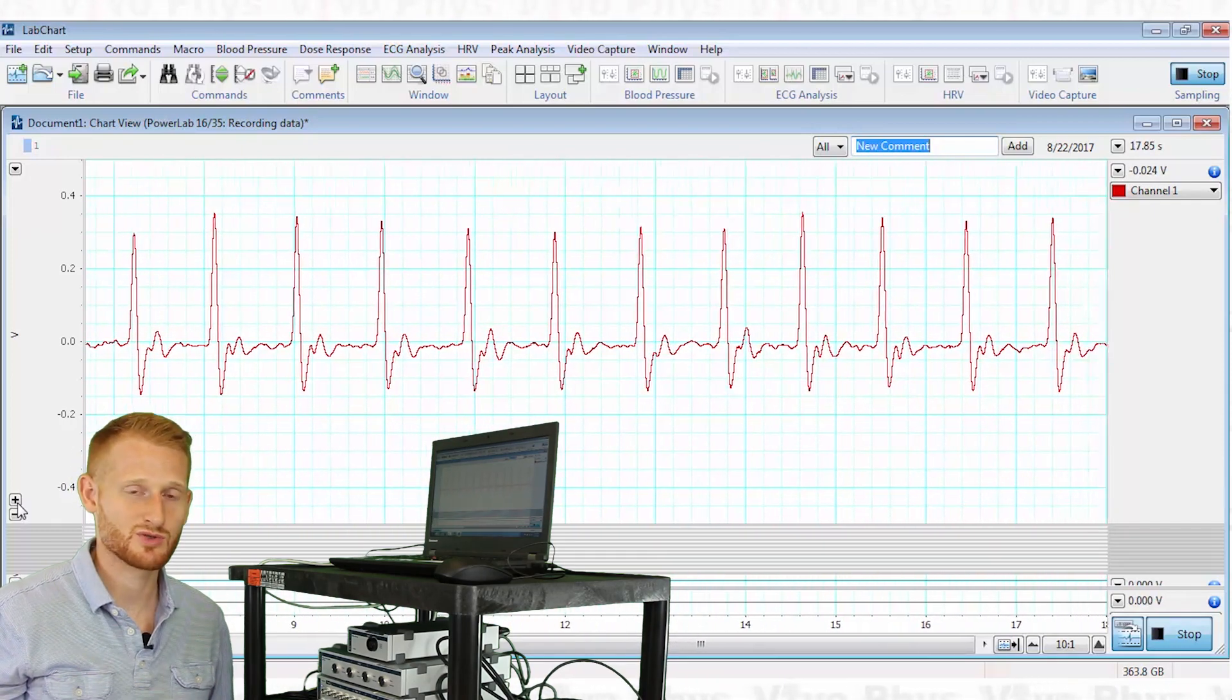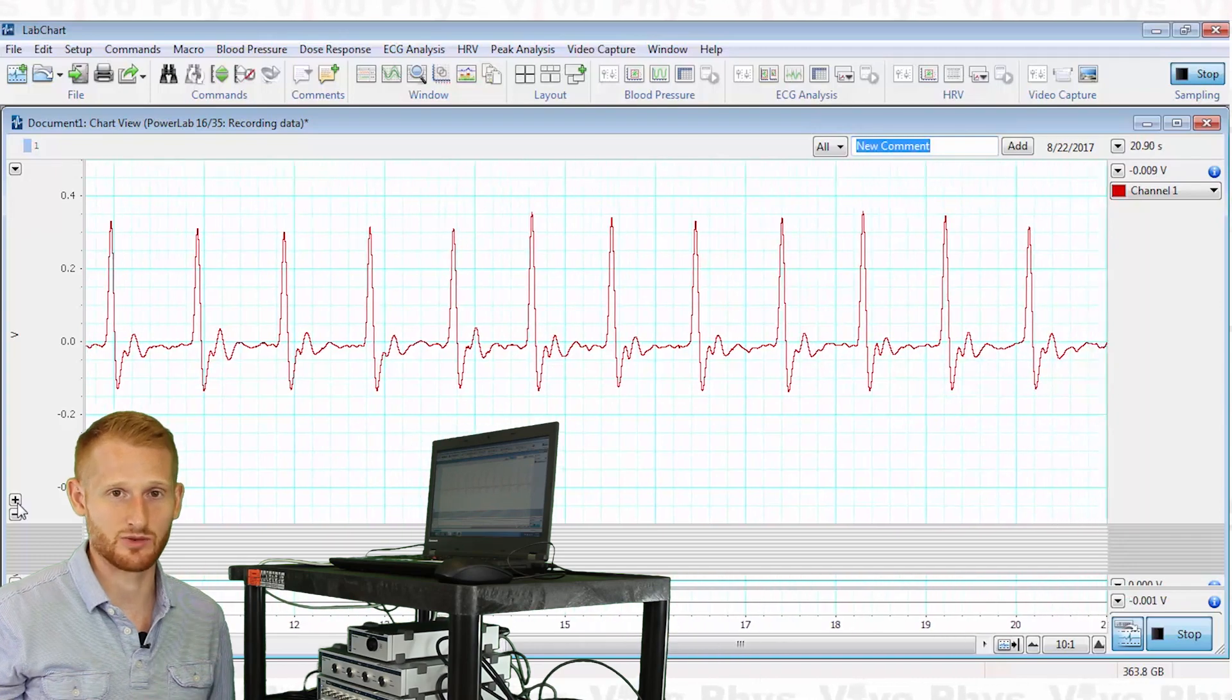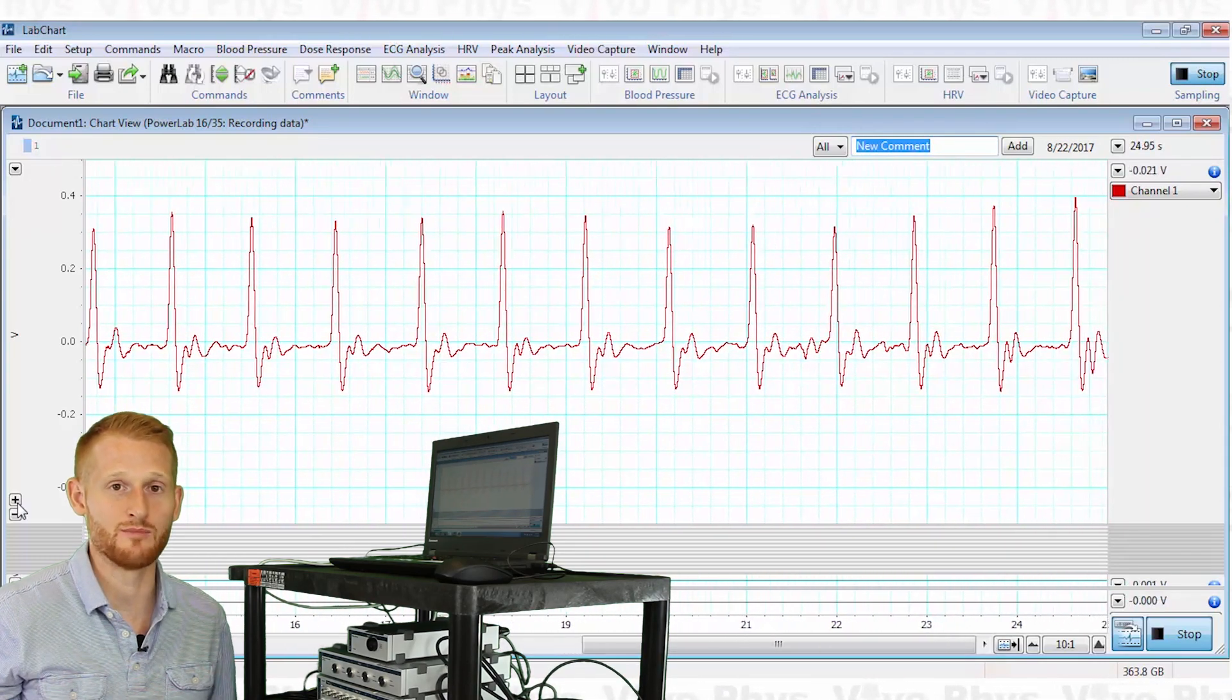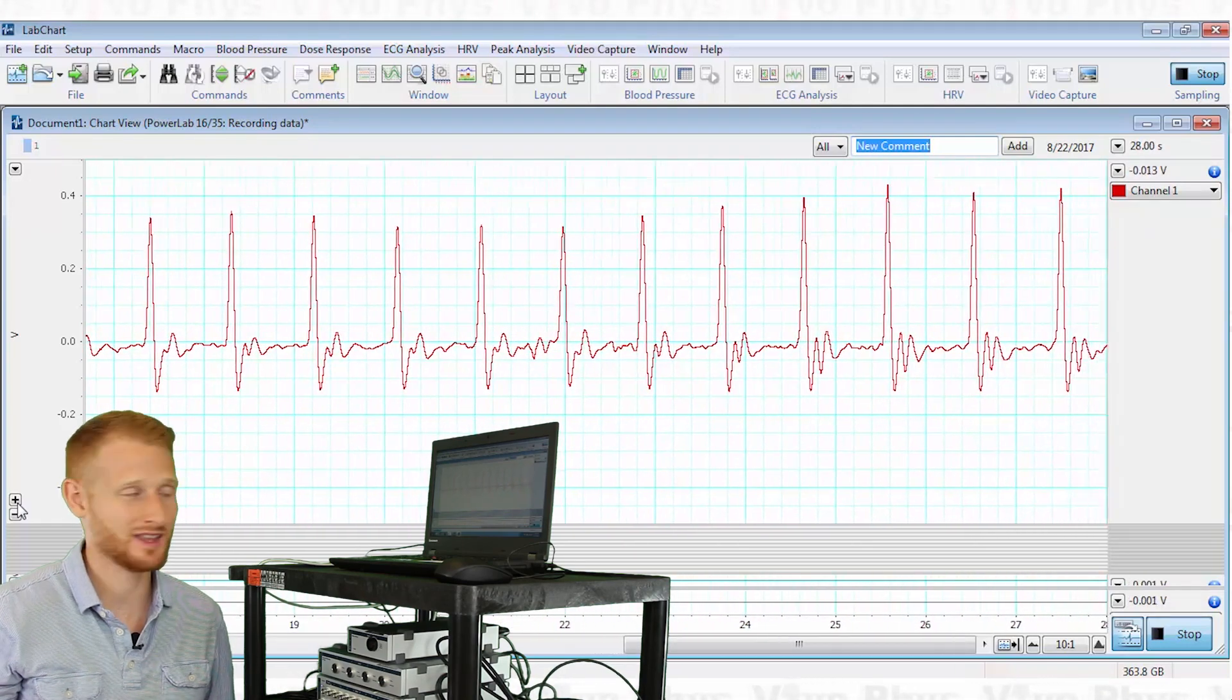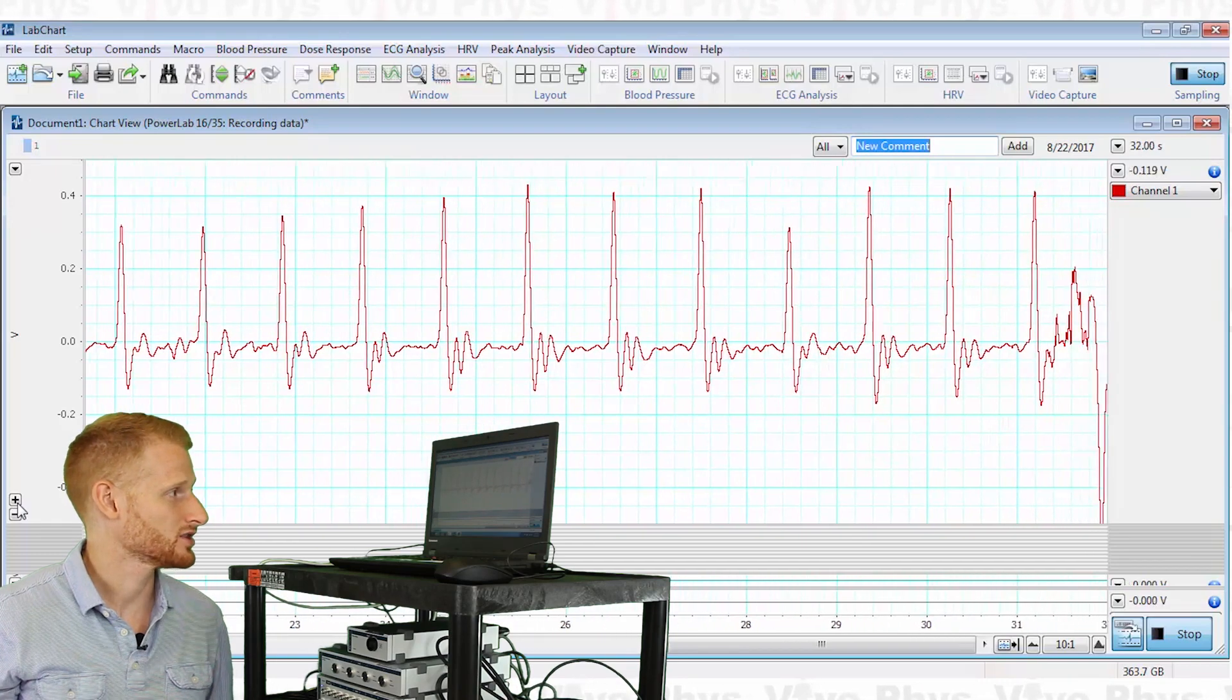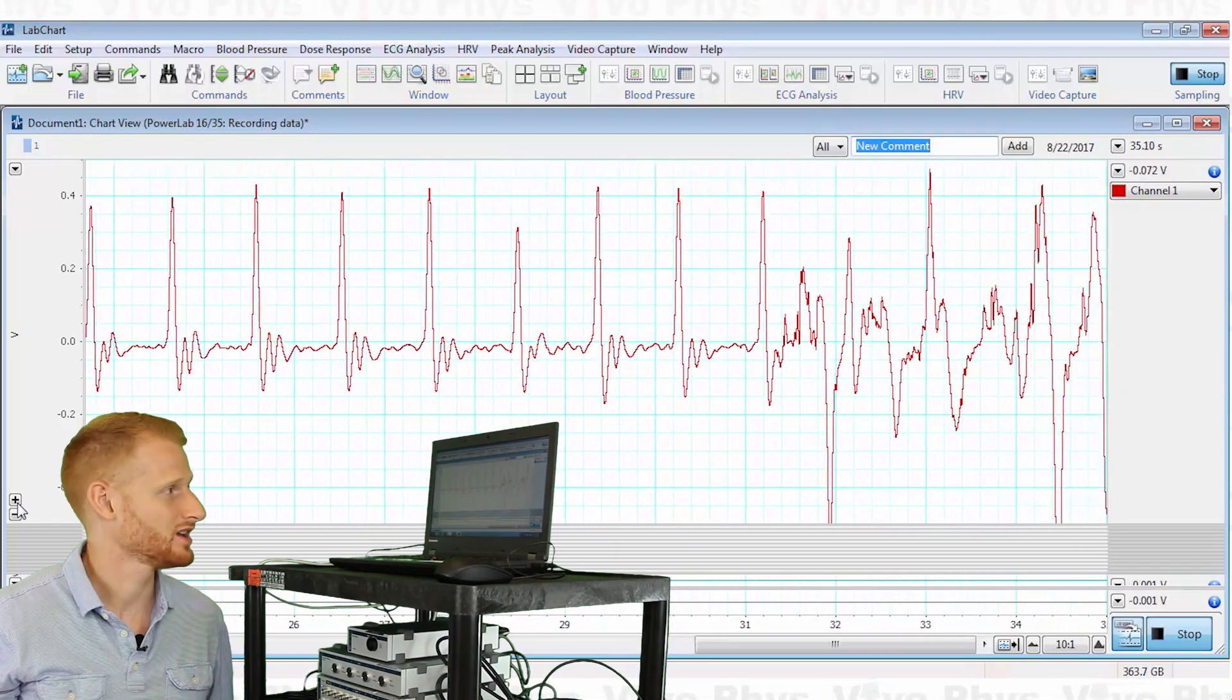You want to make sure that the person doing this is staying nice and still and relaxed, so it's probably best if they're laying down so they're not moving or supporting their own body weight by sitting up like I am. Because if the person moves in any way—I'm gonna move my hand now—you're gonna see all kinds of noise to that signal.